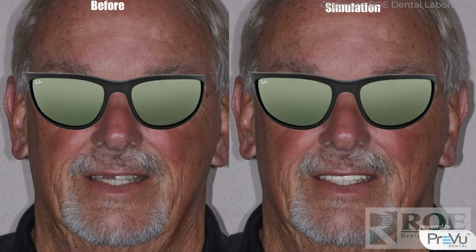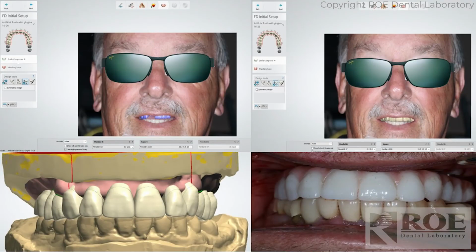Why do we want this nice photo? Because we make smile simulations. This one's okay. We've made I don't know, 5,000 of these smiles over the years. Probably double that, and they really do a beautiful job. But even if the picture is like this, patient has a tough time smiling, we do a smile simulation. We bring it into the software.